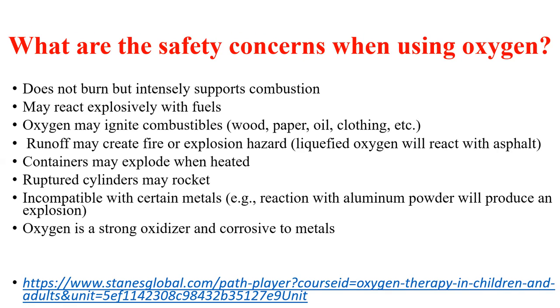In some areas I visited, the oxygen cylinders are not fixed. They are in the ward with patients. So please, if you have oxygen around you, also think about the safety concerns it can create when it is misused or misplaced. Next, please.